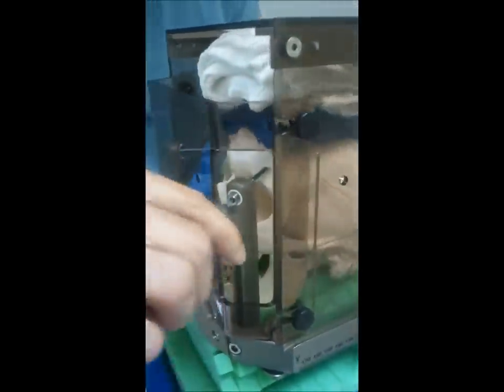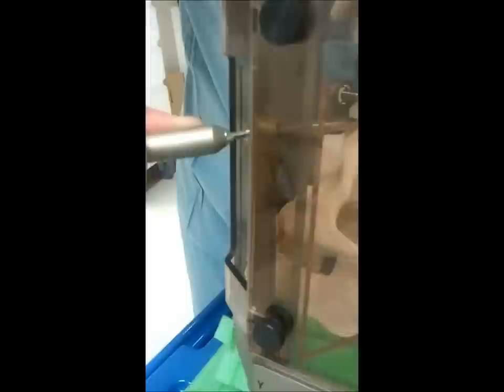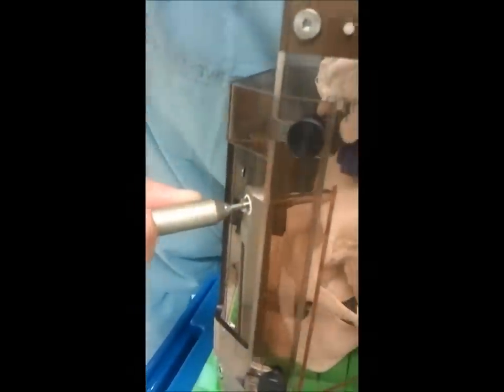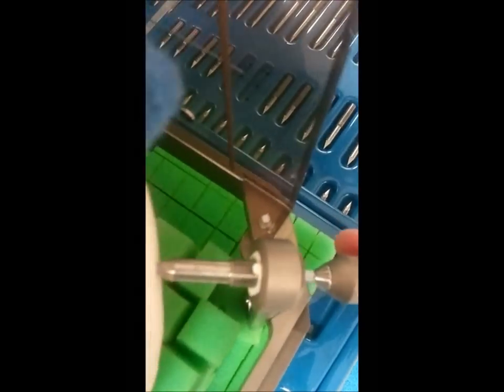As I'm screwing this in, I'm feeling for the tension and the torque. The other thing is, as you're screwing these in, you can sometimes see the actual posts slightly lean back if you look at them just above — in a vertical sense, superior to inferior. You can kind of see that on this back post here. As I'm screwing it back in, it is slightly folding back, just very slightly. It's hard to appreciate that with me moving the skull.